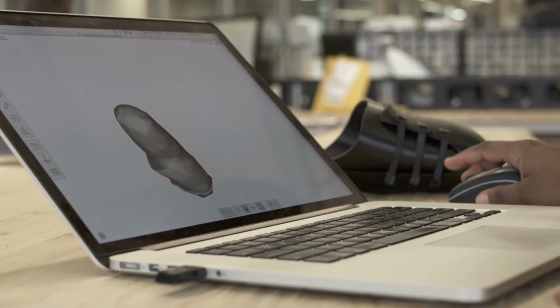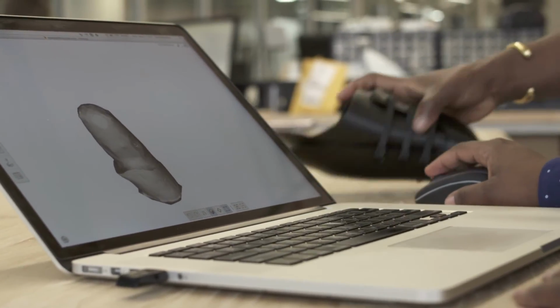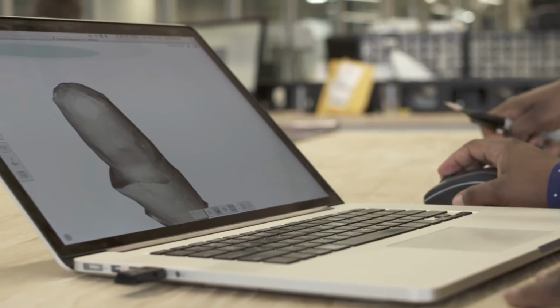So using Remake in this process is very important because it allows you to take the 2D images that you took of the positive mold and makes them into a 3D model that is digital and an exact replica of the residual limb.